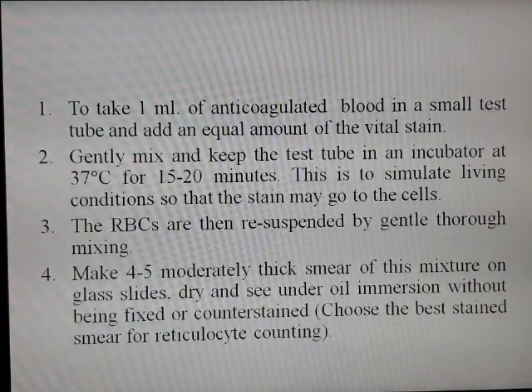Now about the procedure. Under all aseptic and antiseptic measures, we have to take around 1 ml of blood from the person whose reticulocyte count we need to check.